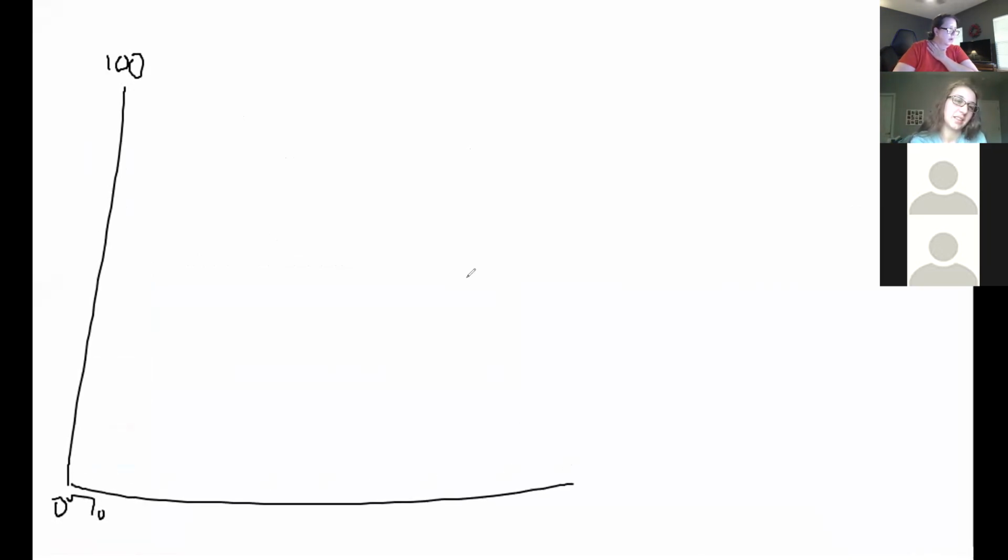Okay. Now what's going to happen, when a pulse oximeter reading starts to go down, it kind of goes like a nice little ski slope, like here, and it goes down. Once it hits 85, it goes like that.